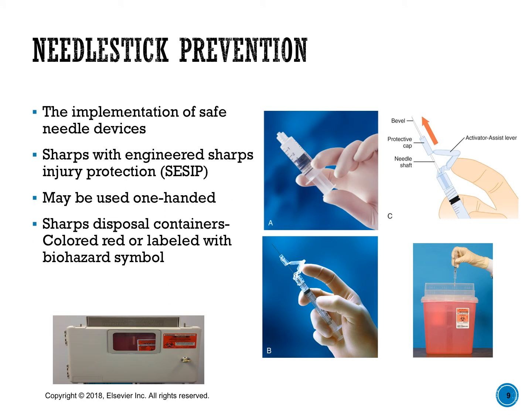But when it comes to sharps, facilities are required to stock sharps that have engineered injury protection technology, so they have to have a safety, and you need to be familiar with how to activate the safety on all of the needles that you use. And if you're drawing up a medication at the medication cart and you need to recap, remember to use the scoop method so that you don't accidentally stick yourself.